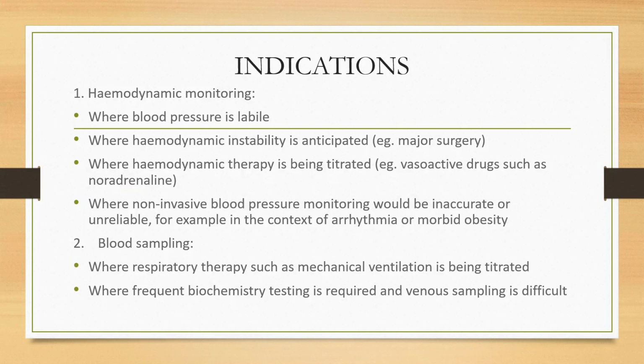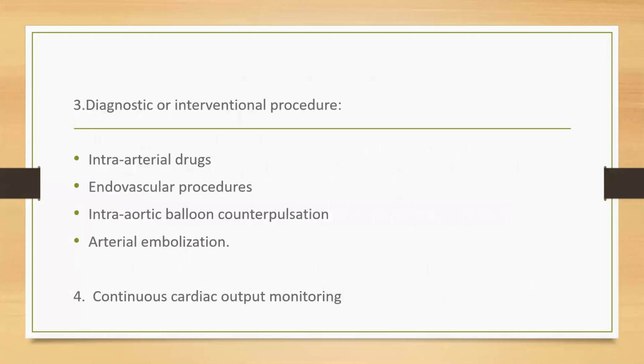Blood sampling techniques, where respiratory therapy such as mechanical ventilation is being titrated, where frequent biochemistry testing is required and venous sampling is difficult. Diagnostic or interventional procedures, intra-arterial drugs, endovascular procedures, intra-aortic balloon counterpulsation, arterial embolization, and conditions where continuous cardiac output monitoring is required.